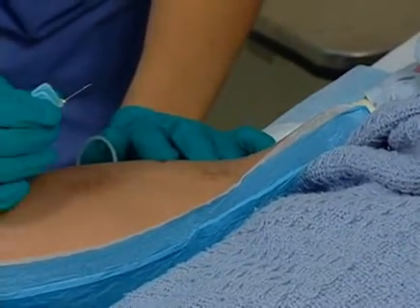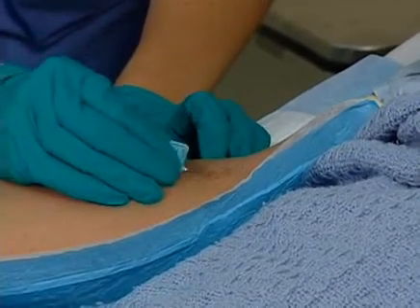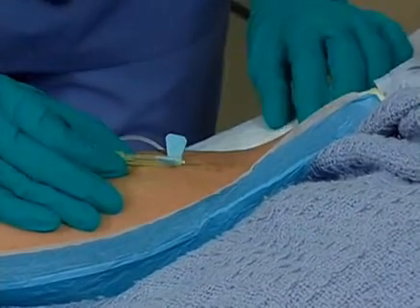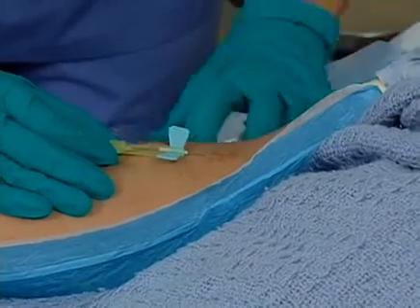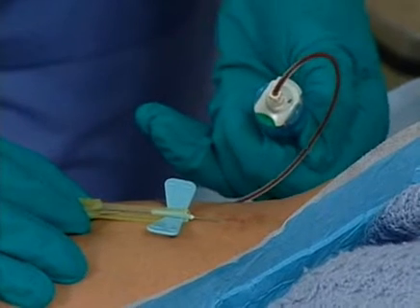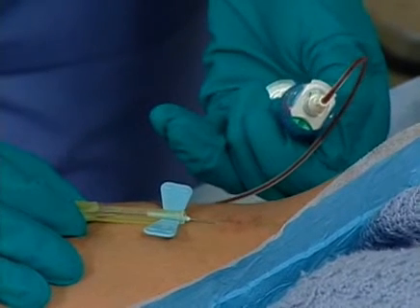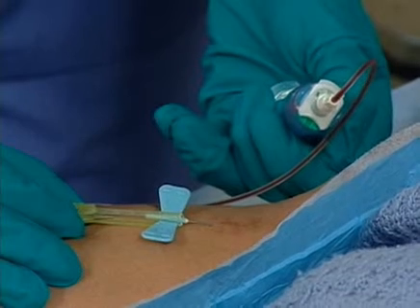Be sure that you warn the client of the needle stick. Hold the needle in your dominant hand with the bevel up at a 30-degree angle and insert the needle slightly distal to the actual entry point into the vein. When you can see that there is blood return and the needle is successfully in the vein, insert the blood tube into the vacutainer holder.